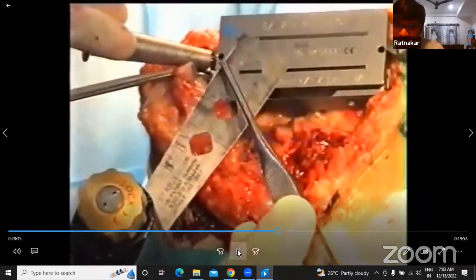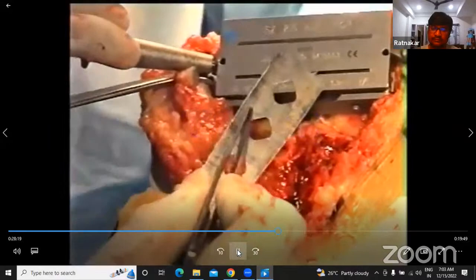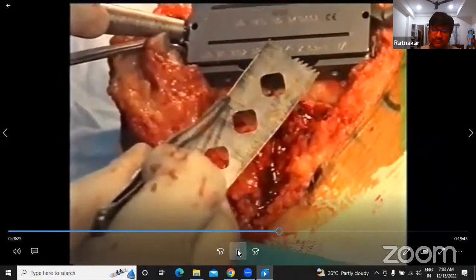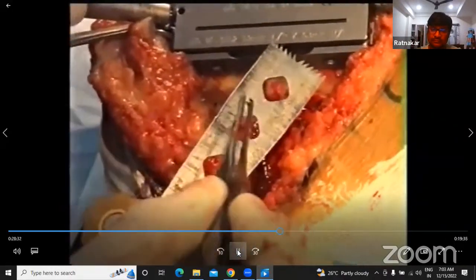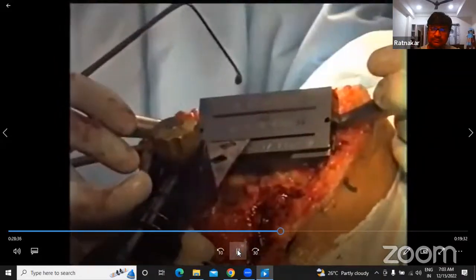Let us say you can have a visual estimate of this blade, how much it can go inside to the posterior part of the popliteal fossa. Probably let us say 30 millimeters. We should go only up to 30 millimeters, not up to 40 millimeters. It's always safe to cut less and then go for the osteotome, rather than all the way going and hitting the popliteal artery. I'm going for the anterior chamfer.